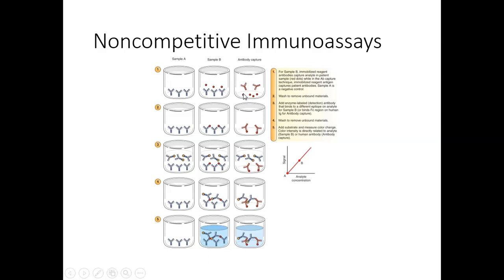Before it gets this term, we're going to continue to look at that, and we'll redefine these just slightly for you as you go along. This isn't a capture antibody. This is an antibody capture. Remember, capture antibodies are the ones that are bound. An antibody capture procedure is when antigen is bound and it captures antibodies in solution. I can't believe they named all of this the same with just different combinations of words, but they did. The nomenclature, that's the way it is, so we'll have to live with it. So just like we saw here, sample A, no antigen. Spoiler alert, sample B has antigen, and we'll look at antibody capture in a few minutes.